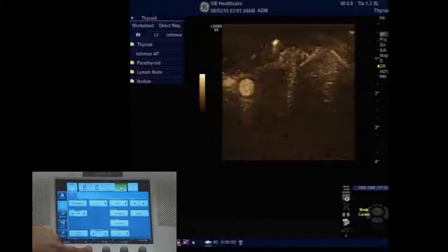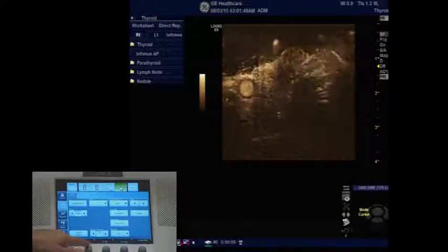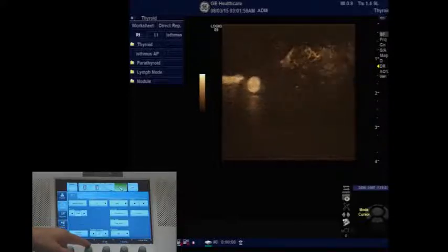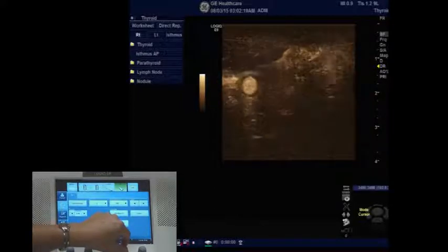However, as the PRI is increased, the image has potential to flash due to interleaving or mixing of the signals. Decreasing the PRI is useful in high flow conditions and helps to minimize flash. However, as the PRI is decreased, sensitivity to small vessels and slow flow states is reduced. Similar to B-mode, frequency is changed based on whether more penetration is needed. When using B-Flow, frequency may be adjusted to see deeper structures.